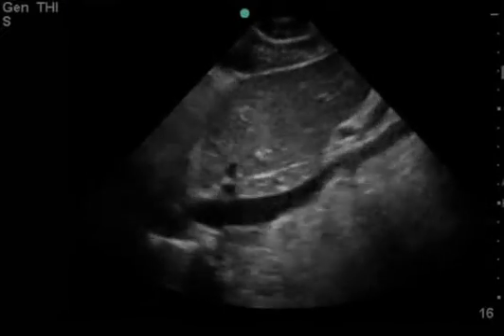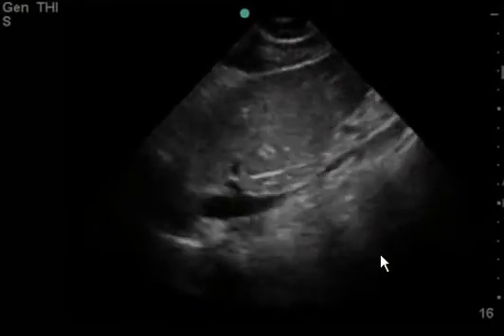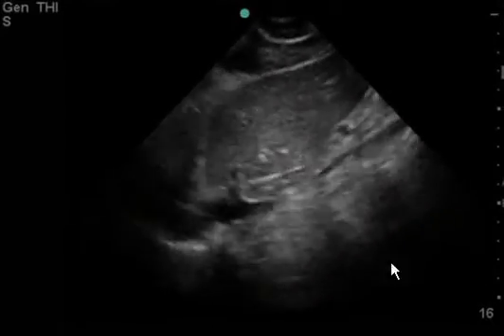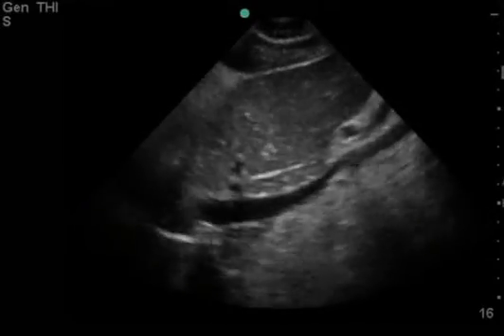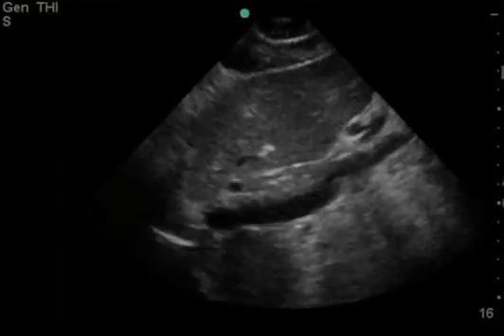So this is a patient with cardiomyopathy that if you had an 88-year-old with this history, you'd be scared to give IV fluids. Seeing both this echo and this IVC, you can give this patient 2 liters and not be concerned whatsoever. This patient got 3 liters of crystalloid, lactate cleared, and no longer needed ICU level of care.